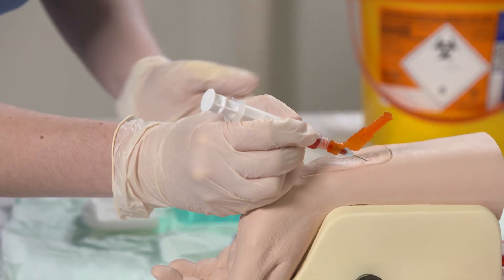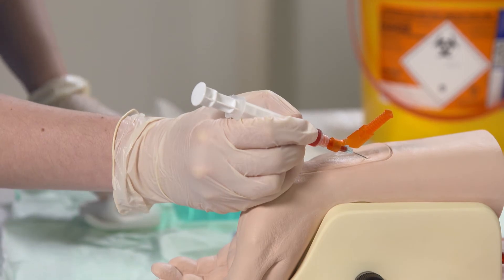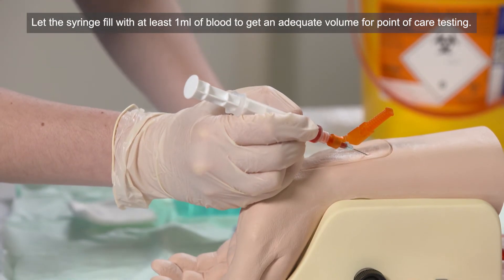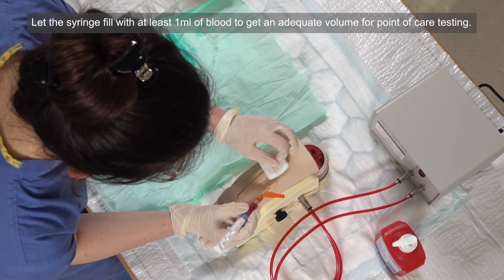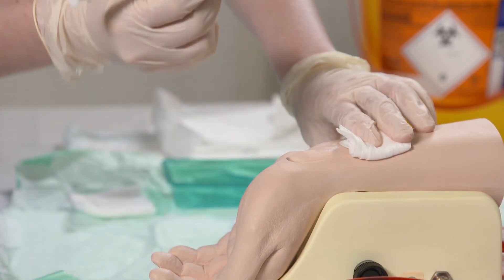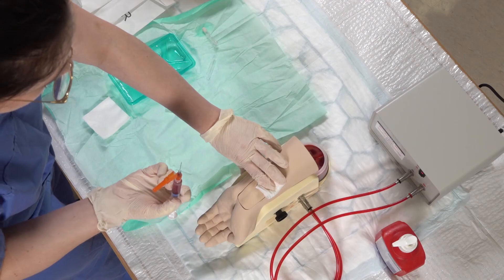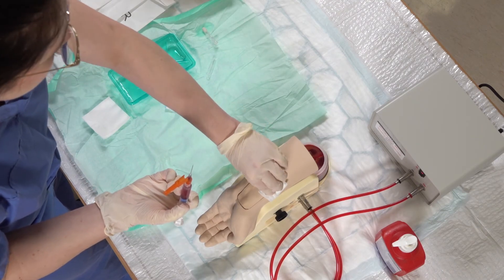We can see that the needle is self-filling now. Once there's an adequate amount of blood in the syringe, withdraw the needle, placing some gauze on top and putting pressure on that area. You can ask the patient as well to hold that down.